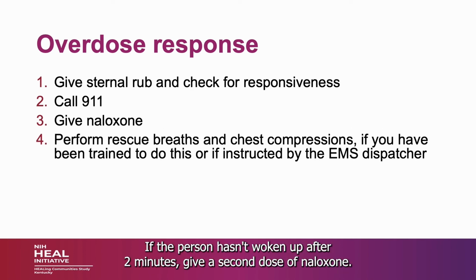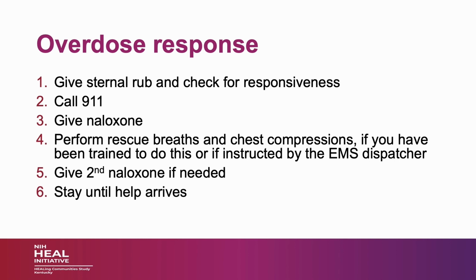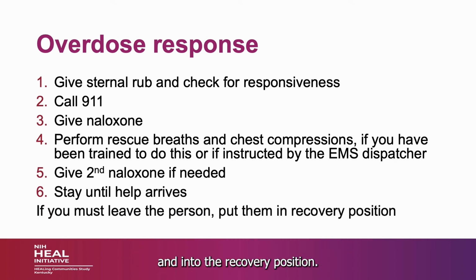If the person hasn't woken up after 2 minutes, give a second dose of naloxone. Always stay with the victim until EMS arrives. If you must leave the victim for any reason, roll them onto their left side and into the recovery position.